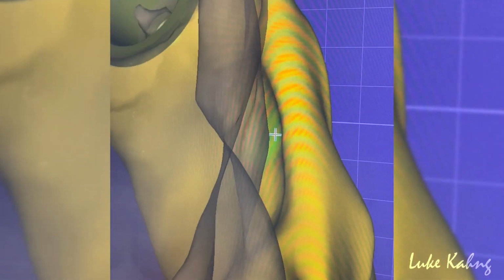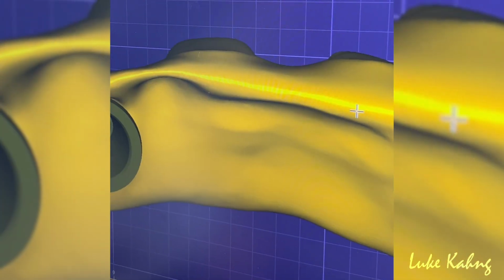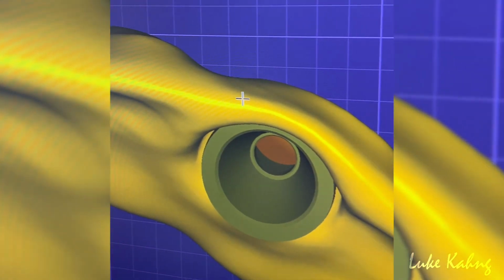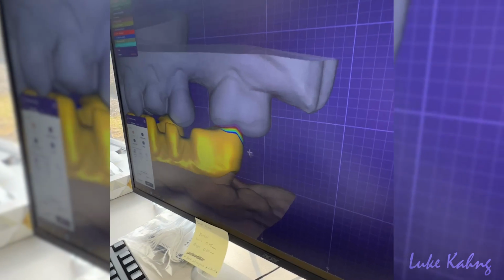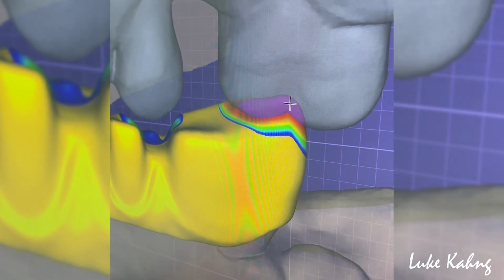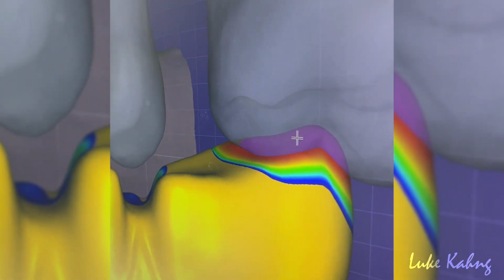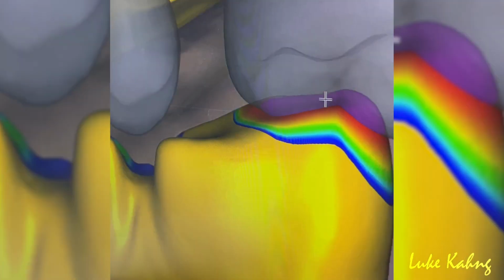Basically, we open underneath about 1 millimeter for the hygiene. This is what I'm trying to do inside, but I worry about the edge area for the aesthetics. So we made a better island for the framework. Because there's no room, the implant access hole is just sticking out. We're going to polish that area, and then we'll open the zirconia on top of that.